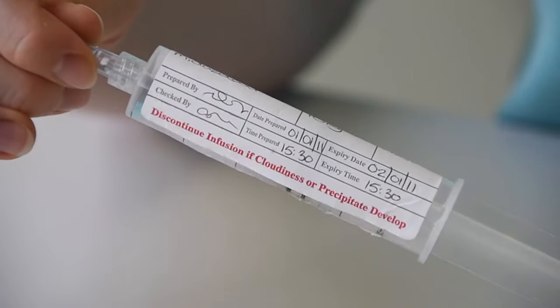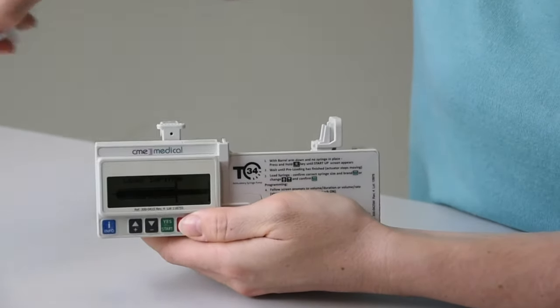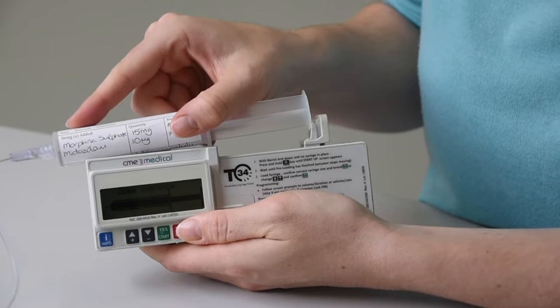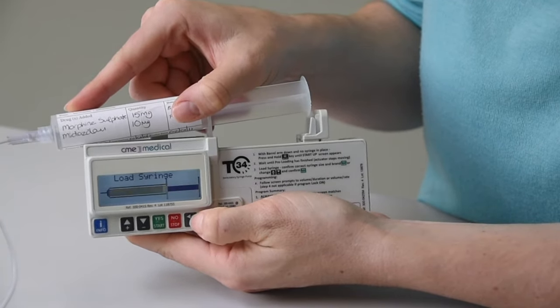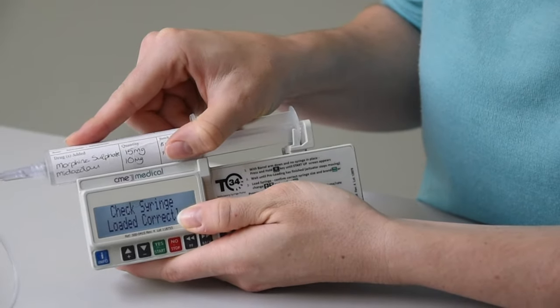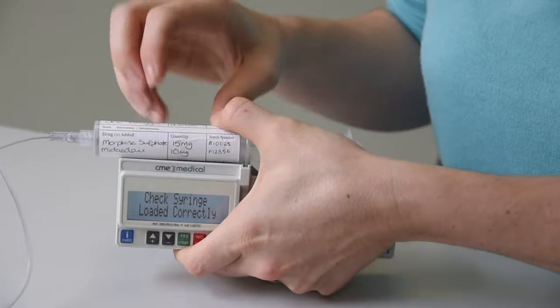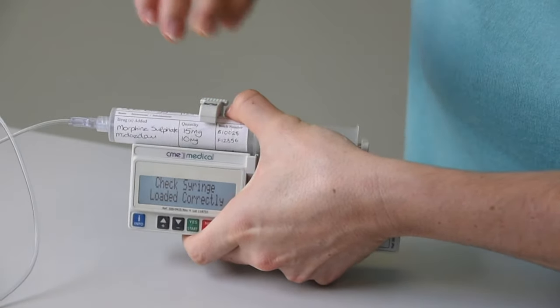To load the syringe, lift up the barrel clamp arm, line the syringe up along the barrel and use the arrow keys to move the plunger to the right spot. It is important for this to be accurate and not forceful, as not to waste any medication. Once the arm has been replaced, pull the barrel arm clamp up and over to secure the syringe in place.